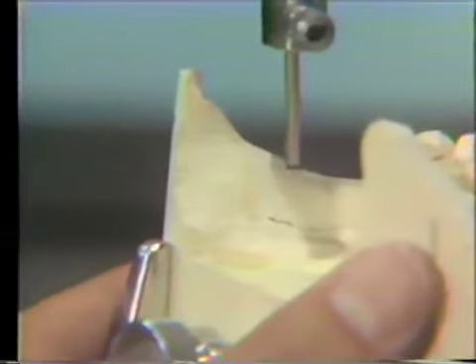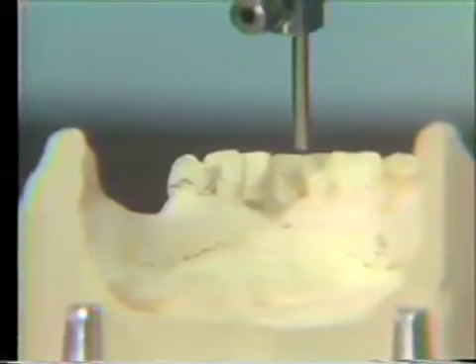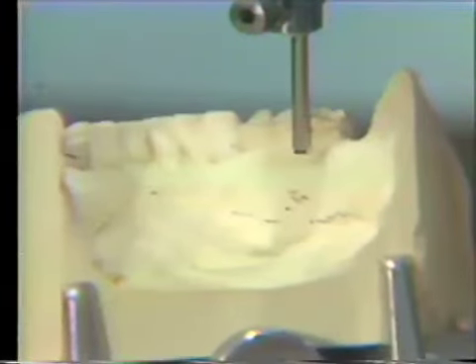I could probably use this crease on this side, about halfway down the length of that crease to indicate it. Let me try one more. Maybe the height of that incisal edge, and see where that comes in relationship to other things.